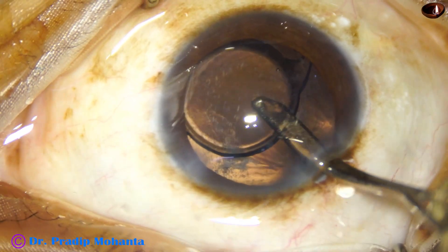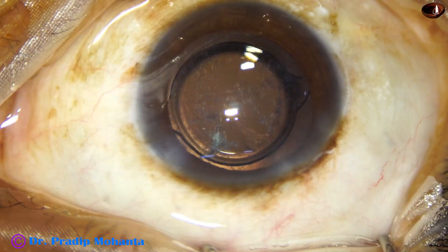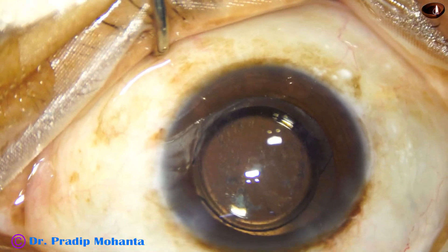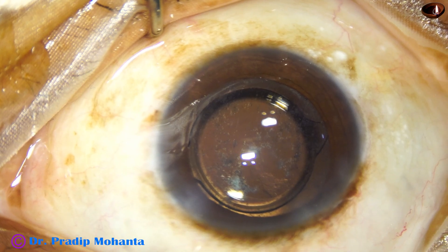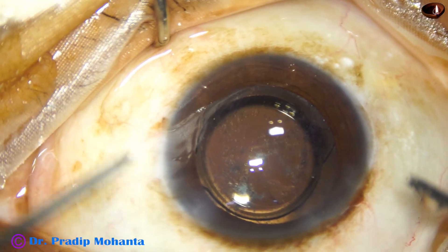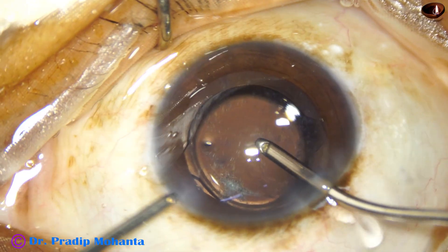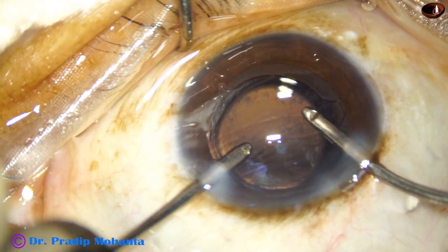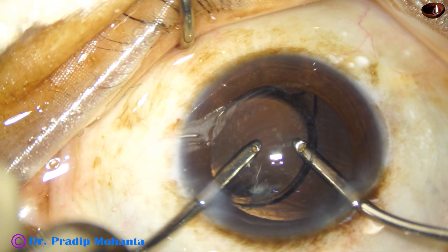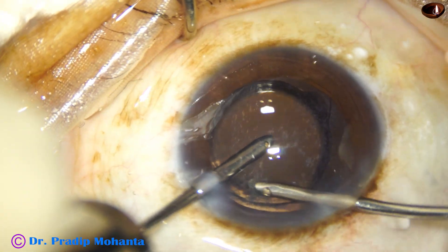If you have done hydroimplantation, this step is not required. Go behind the lens always — just push the lens, come to the edge of the lens, and very gently go behind the lens, and nothing will happen to the posterior capsule. Be gentle. Clean the Visco that is between the intraocular lens and the posterior capsule. Sometimes a lot of viscoelastic substance is trapped in this space — it can cause a rise of intraocular pressure in the postoperative period. Even at night the patient can have discomfort, pain, or steamy corneal edema. Next day the patient will not be happy. So clean the Visco between the lens and the posterior capsule very nicely.